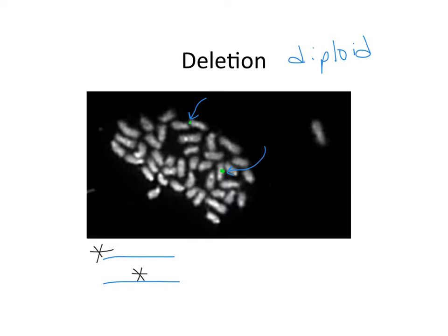One of the things that this might mean is that there used to be some DNA sequence here on this first chromosome that has recently been deleted, leaving that FISH signal apparently on the end of the chromosome, where on the homologous chromosome it's not on the end, it's in the middle. So the change in location on a chromosome of a FISH probe can be indicative of the presence of a deletion of part of the chromosome.